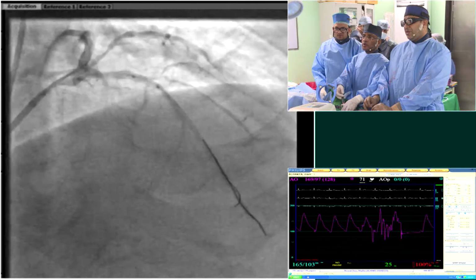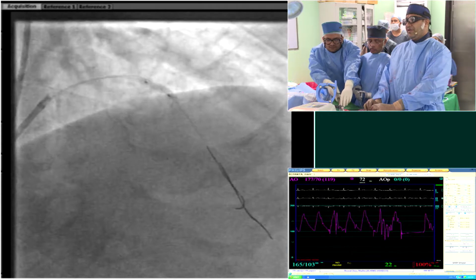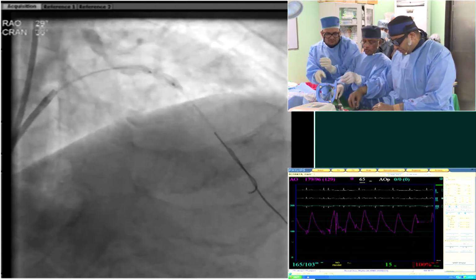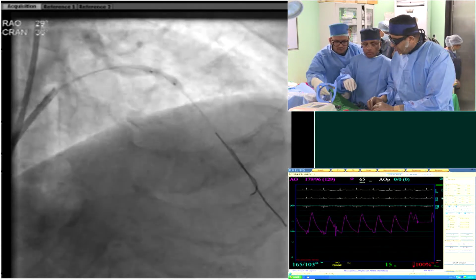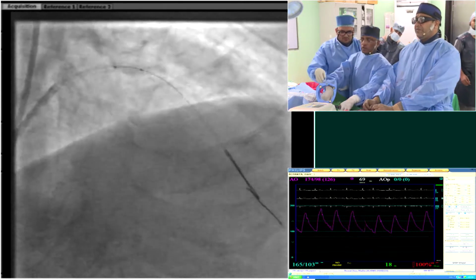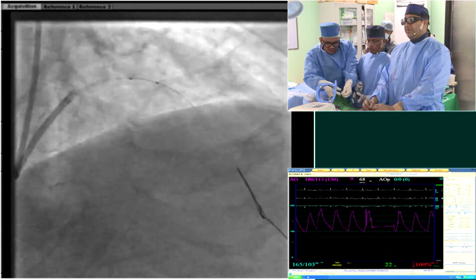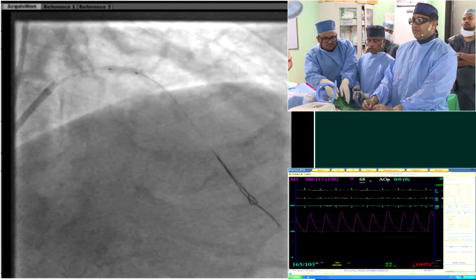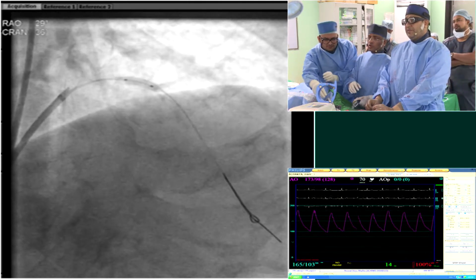Let's do it here at this point. 14. Down. Approximately. Good. Don't mix the wires. Where's the other wire? We won't mix the wires, so we'll do it later. Okay, go up here again. Check. Yeah, approximately we are good. First, let's do this and then we go proximal. 14. Down. Approximately.